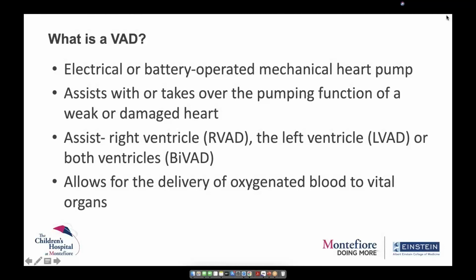And this is the most important part of a ventricular assist device. Very important to know this only supports the heart. It does not support the lungs. So unlike a heart-lung machine, where both your heart and your lung are supported, a ventricular assist device only supports your heart.